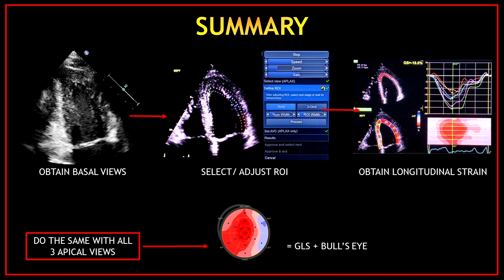Here is a summary of the protocol. First, obtain your apical two-chamber, four-chamber, and three-chamber views. Then select the correct view and the region of interest, using the blue menu on your right-hand side to manually adjust anything you're not happy with. Once you process and approve your selections, you will obtain the longitudinal strain of that view. Do the same with all three apical views and you will obtain the global longitudinal strain and the bullseye. Remember, the more you do this, the easier it will be — it's all about practice.